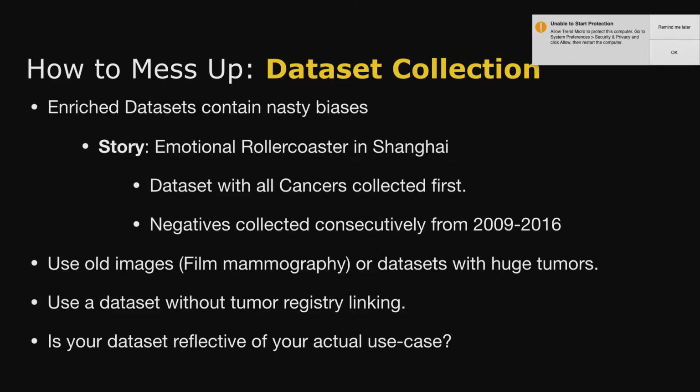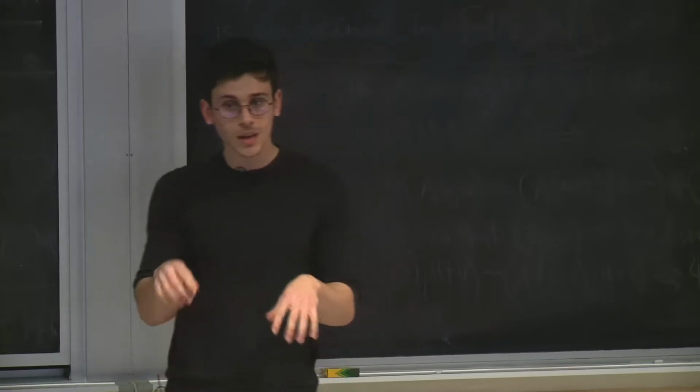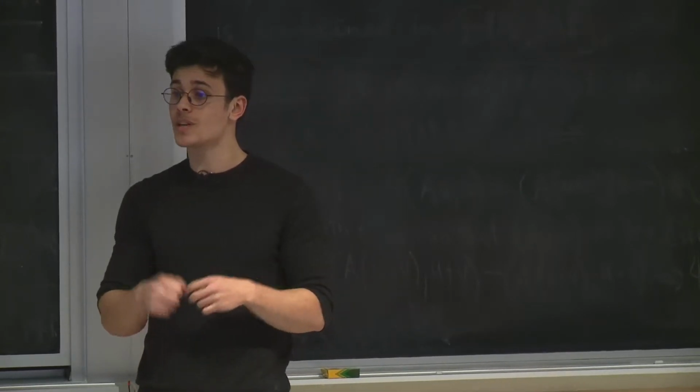And then I had some suspicion: wait a second, this is too high, this is too good. And we quickly realized that all these numbers were kind of a myth. If you do these kind of case control things, unless you're very careful about the way it was constructed, you can easily run into these issues, and your testing set won't protect you from that.